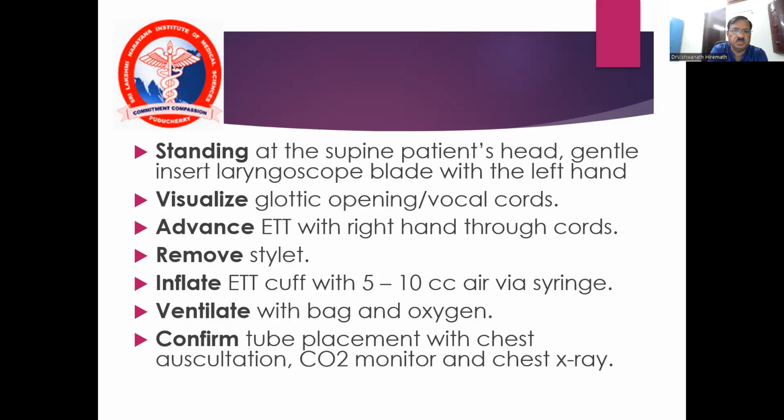Then for the indicated intubation, the procedure will be: open the mouth by chin lift and jaw thrust.